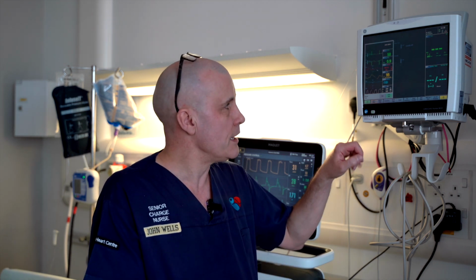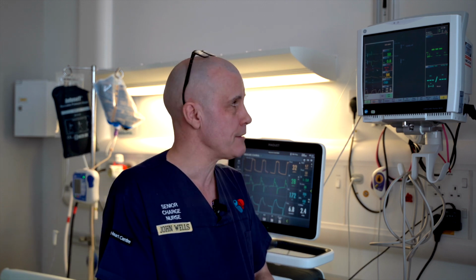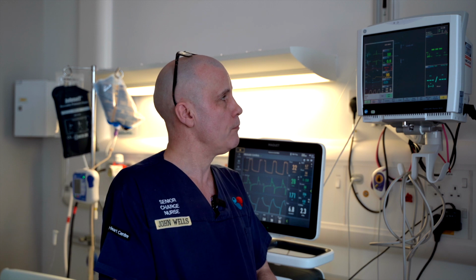In terms of setting up these monitors, they should have the patient's name, certain biographical data in them, and then we set up these waveforms as standard. And then we set up alarm settings. Again, they can be adjusted. For example, with this patient, which is a good example, as I've said before, normally we would set the alarms to alarm with a heart rate of 60, but this patient is absolutely fine according to the parameters set by the big brain doctors, the consultant intensivists, because we're achieving our mean with a nice slow rate. So obviously there's no point in having an alarm of 50 because it'd go off all the time.